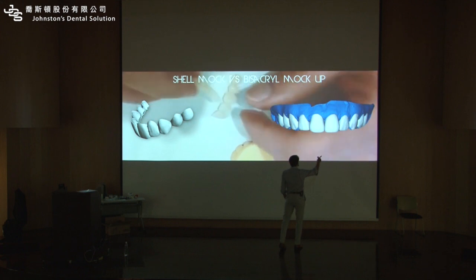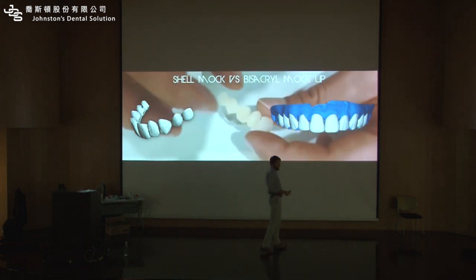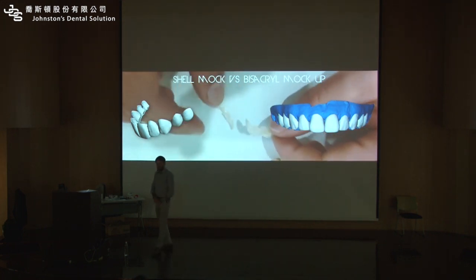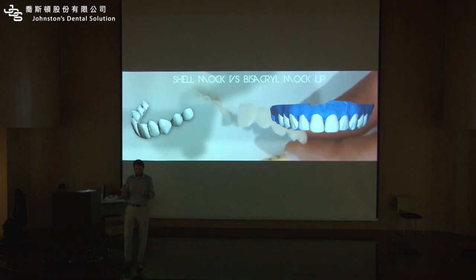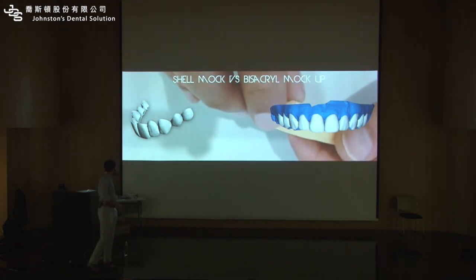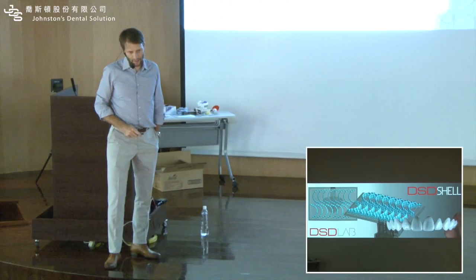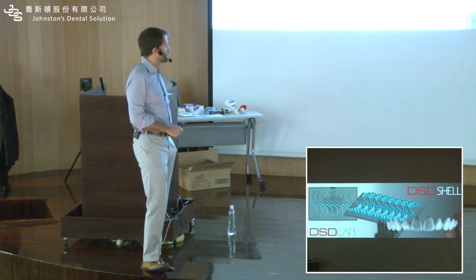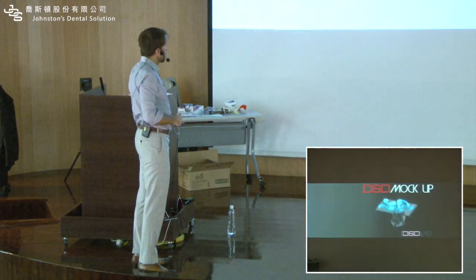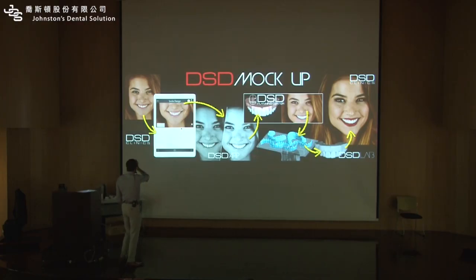This usually takes a little longer, 5 to 10 minutes, because you have to wait to set and you clean. And this one takes 10 seconds. You take it from the box and you do like this. That's it. Okay? So printing machines can do magic nowadays. They really print beautifully. The texture, the shapes, everything is really amazing.